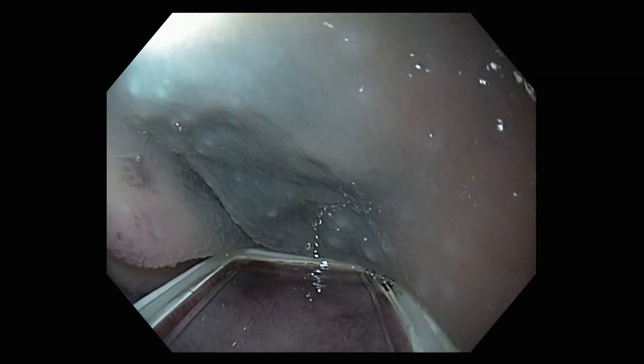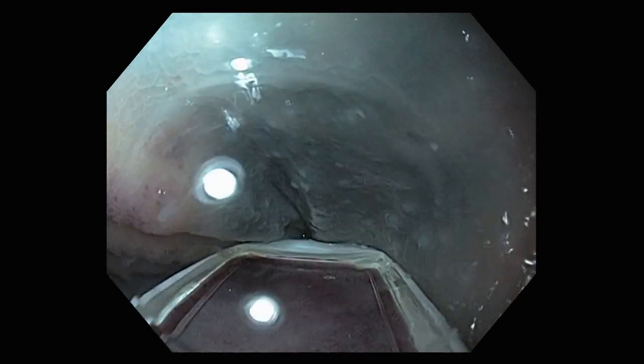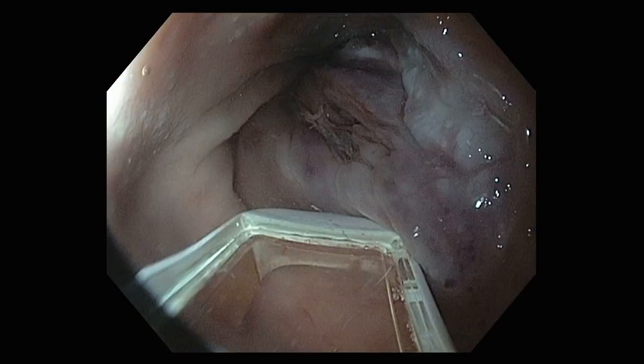Here, the electroporation device was placed on the tumor. Negative pressure applied and energy delivered. Energy delivery can result in vibrations, as seen here. After each ablation, the chamber was irrigated with distilled water to control the rising temperature and prevent thermal injury. The probe was then repositioned to treat residual areas.